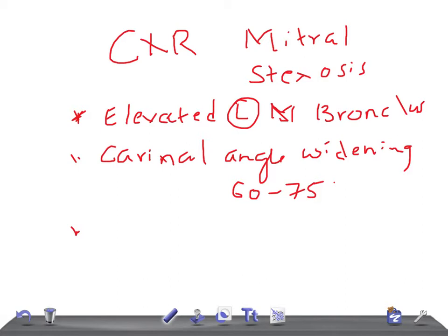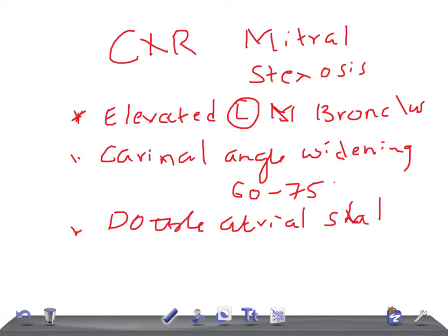Then we have what you call double atrial shadow, also referred to as double atrial density.